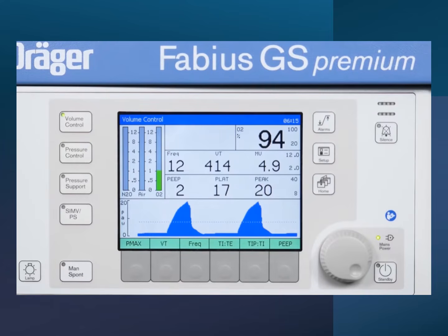Now, each machine is different, and this is what you should practice with the test lung. But I just want to show you how you can change between the two modes, and you can change the settings between the two modes in real time.